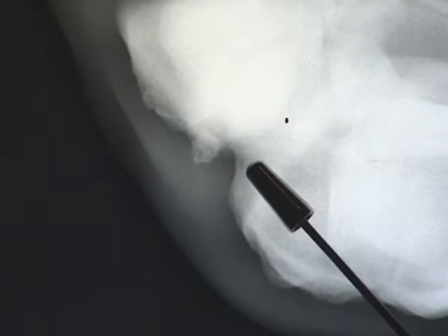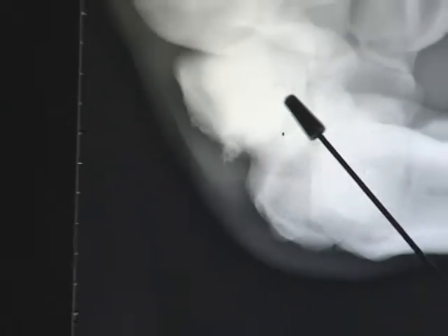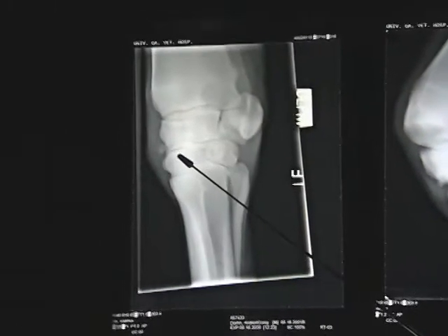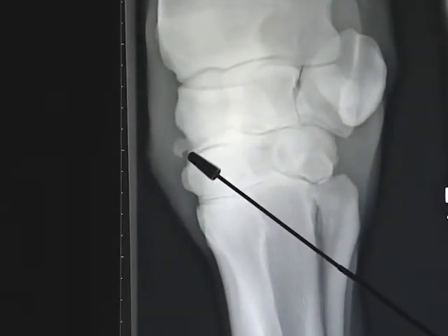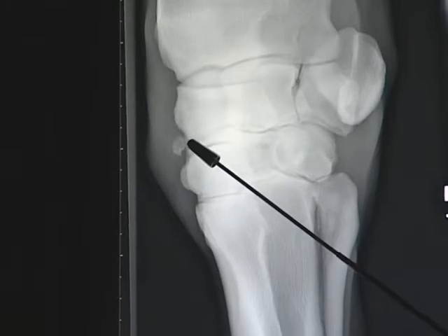So what is this other view over here to the left? What is that showing us? This other view over here to the left is another oblique view of the leg, with the horse standing on it. And you can see this chip sitting right out here to the side.